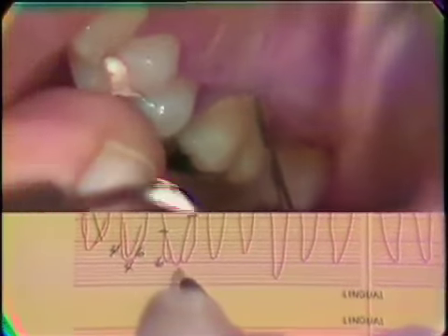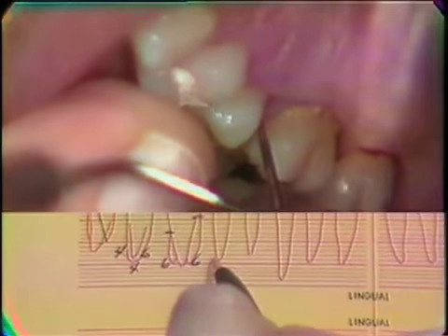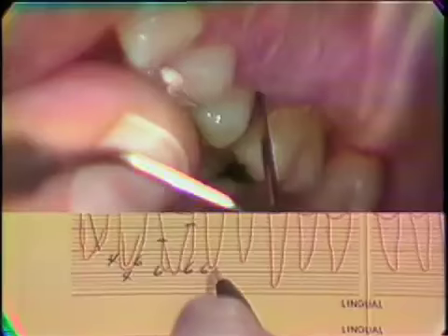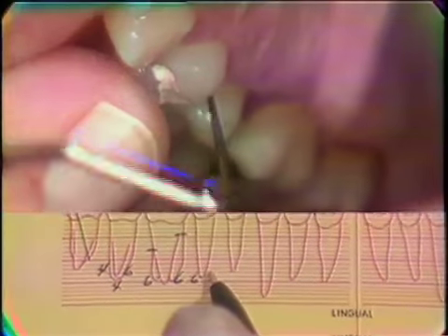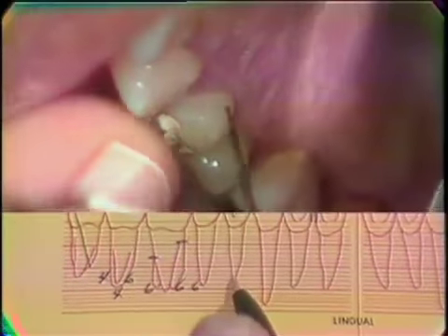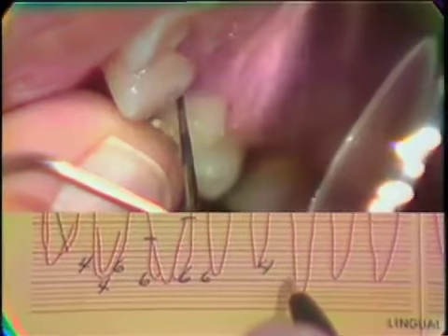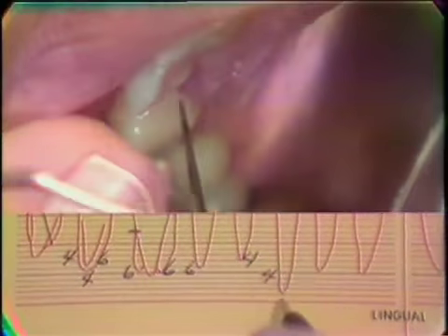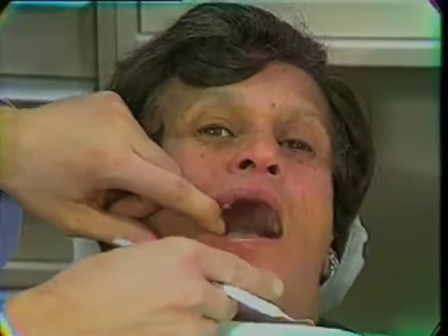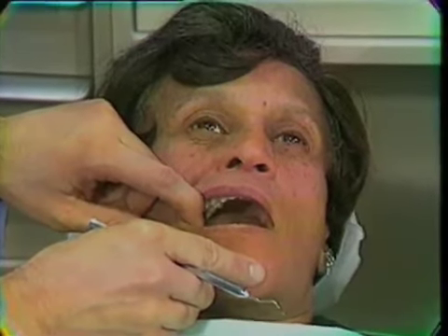That's fine. 3, 6, 6, 3, 3, 3, 2, 4, 4, 2, 3, 4, 3, 3, 3, 2, 4.